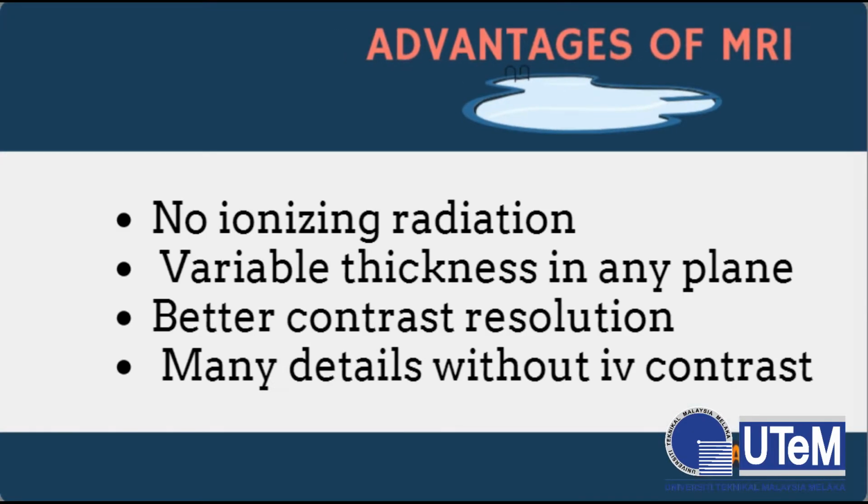Advantages of MRI: no ionizing radiation, variable thickness in any plane. Next, better contrast resolution. Lastly, many details without IV contrast.